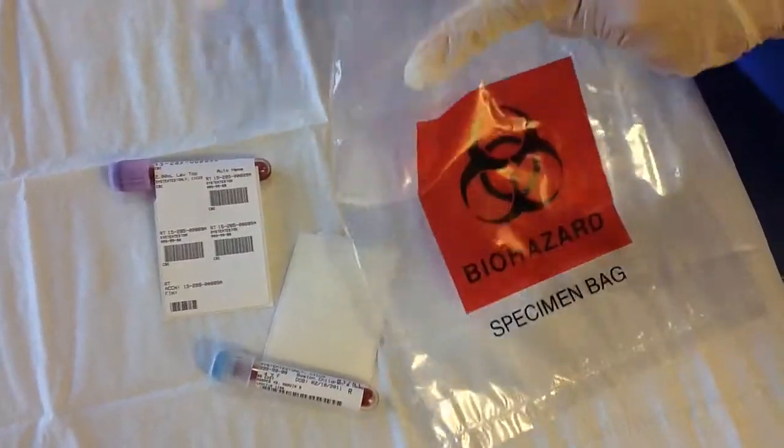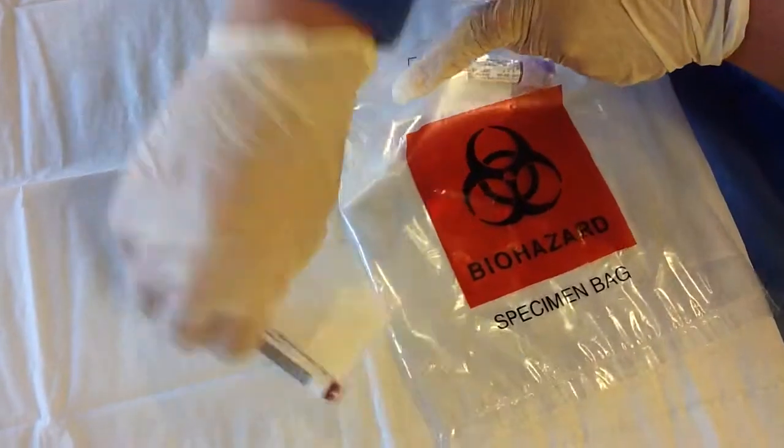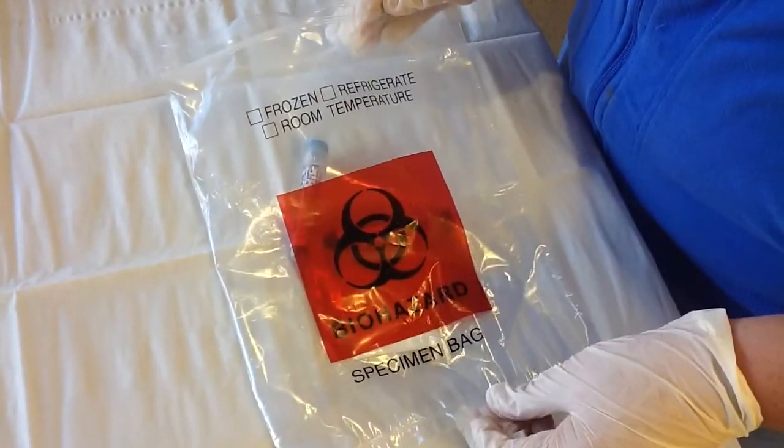Now you're ready to send your labs to lab control. Remember: one patient, one bag, no exceptions.